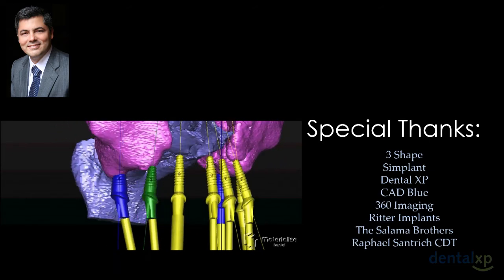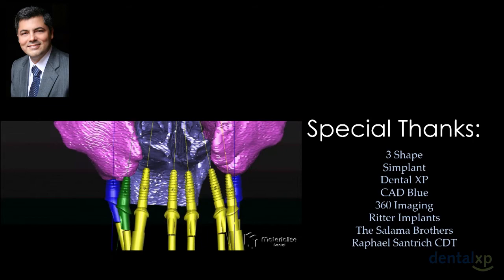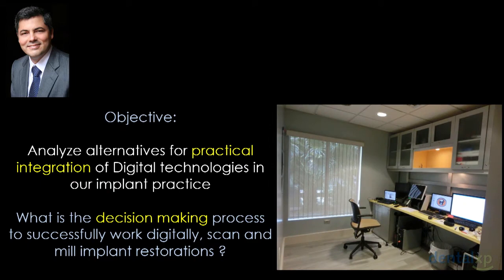I want to thank the different companies that have helped me put this lecture together, because there are major resources in creating all the imaging and major resources related to technology. My objective today is to cover the decision-making process to successfully work digitally, to scan the different preparations or abutments in our patients, to be able to mill or print restorations and deliver successful cases at hopefully chairside.